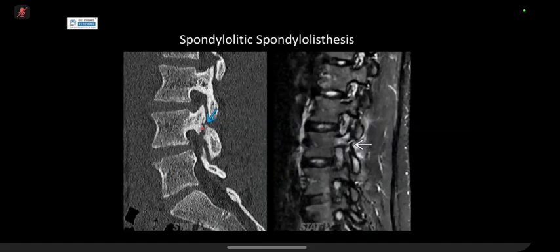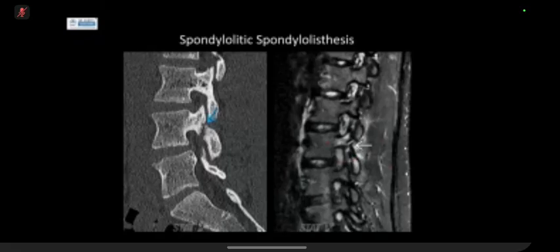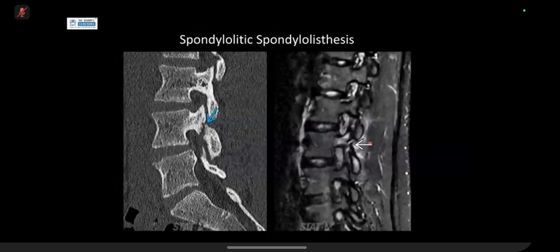Okay, it can be chronic, it can be acute on chronic. It can be chronic or acute, and then on your MRI, of course, if it's acute, you see more marrow edema, soft tissue changes, and if it's more chronic because something had happened and then things have changed, then you see less of the soft tissue inflammation surrounding it. So often you see it in gymnasts or sports which need a lot of hyperextension, like baseball throwing. Yeah, so past event.